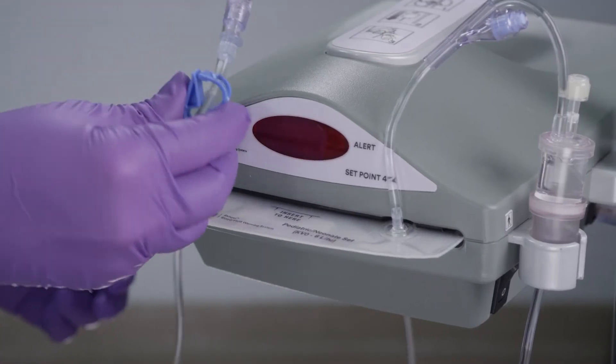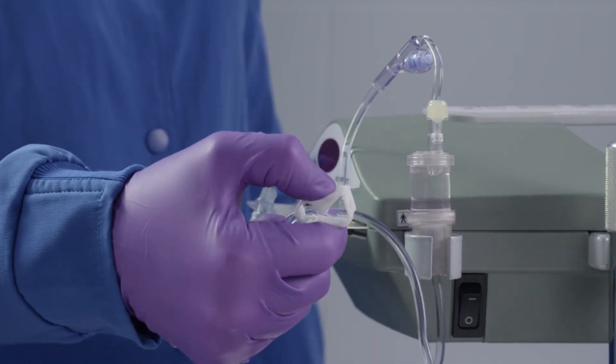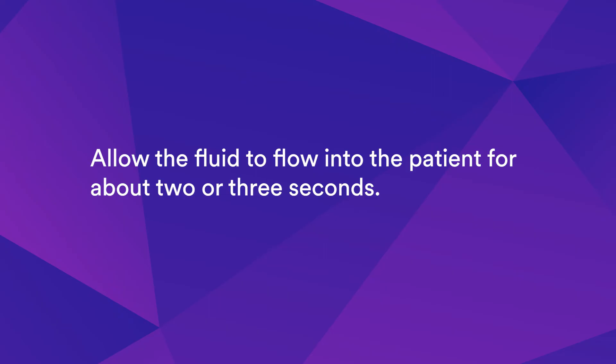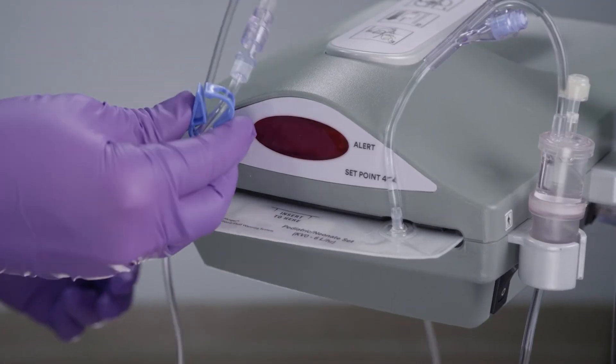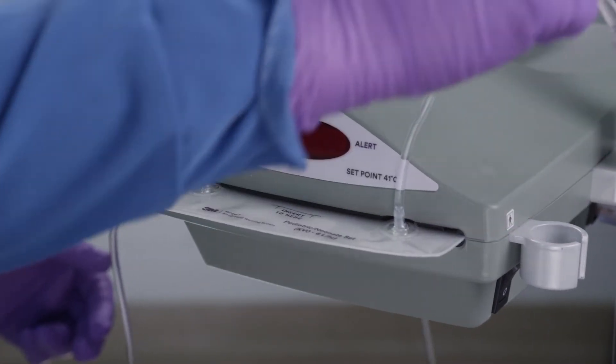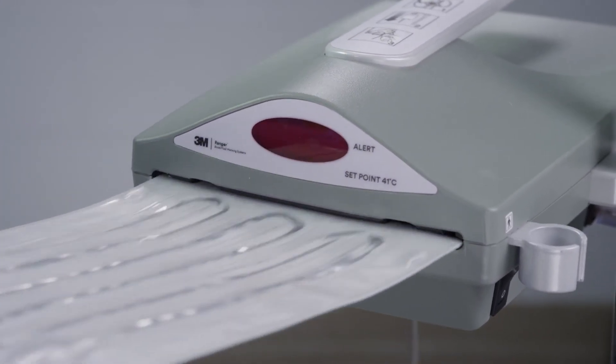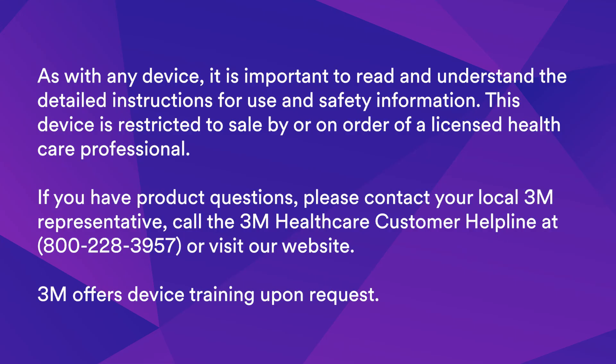Close the inlet clamp proximal to the fluid warming cassette. Open the outlet clamp distal to the cassette. Allow the fluid to flow into the patient for about two or three seconds. Close the outlet clamp. Remove the fluid warming cassette from the warming unit and discard according to institutional protocol.